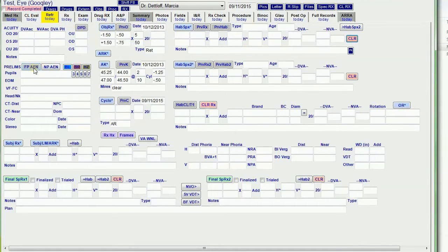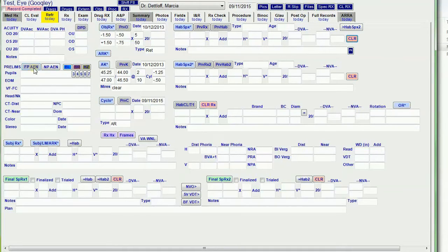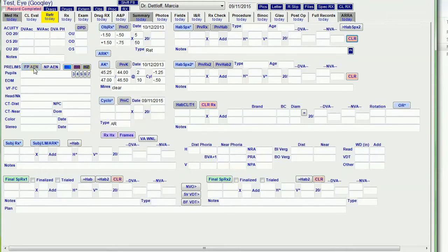These are all else normal buttons. All of my all else normal buttons only fill in the default value if the field is empty. So I typically go through and enter anything that's unusual.